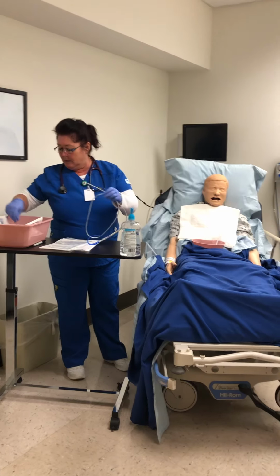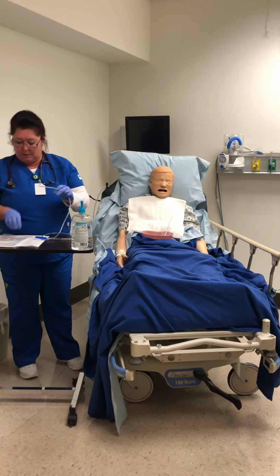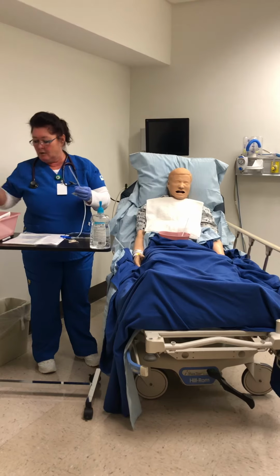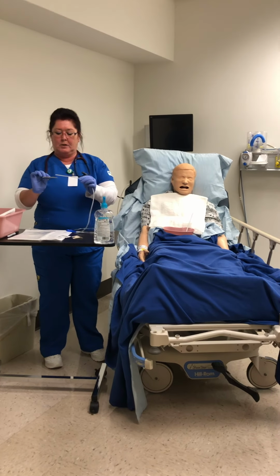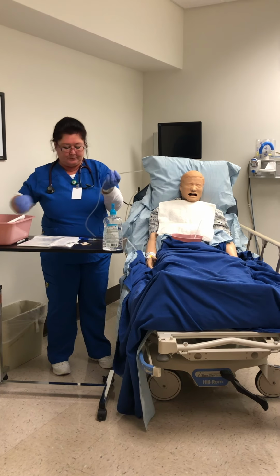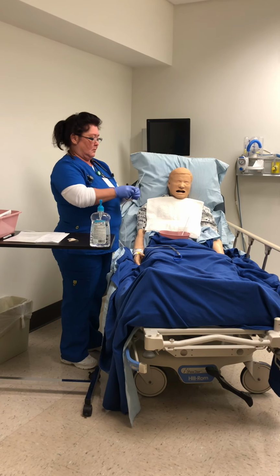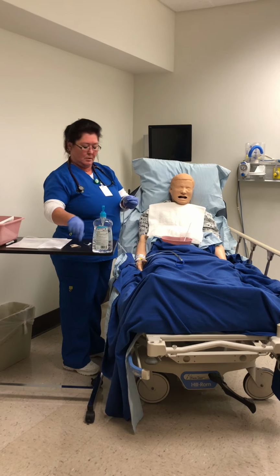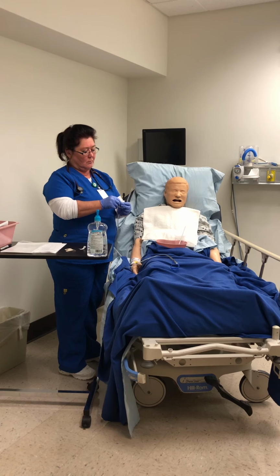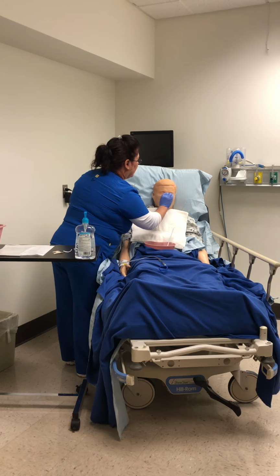So I am going to get my lube, and I'm going to get my adhesive for the nose, and I'm going to get an alcohol pad, and I am going to lube 3 to 4 inches of the tube. And I'm going to clean Shirley's nose real quick, so that by the time I'm ready to attach it, it'll be dry. Okay, Shirley, we're just gonna clean right here.